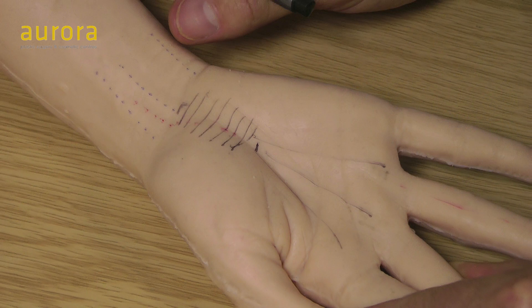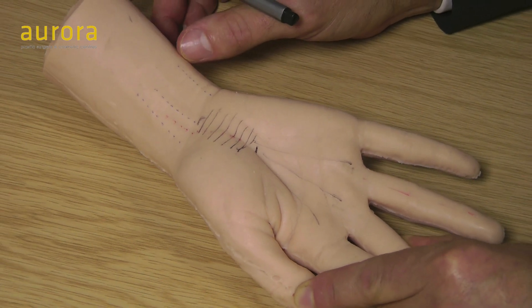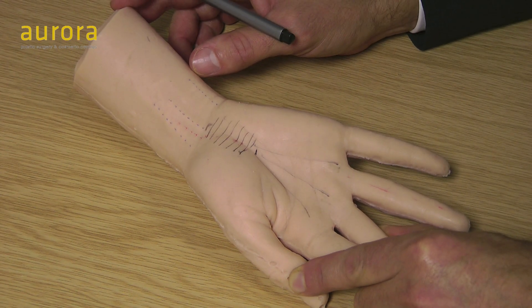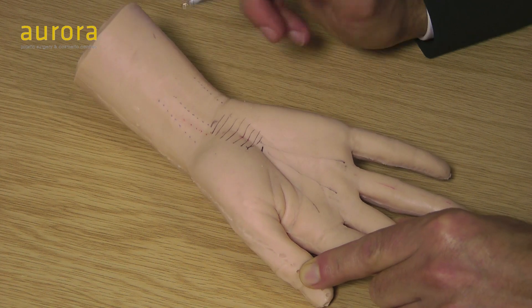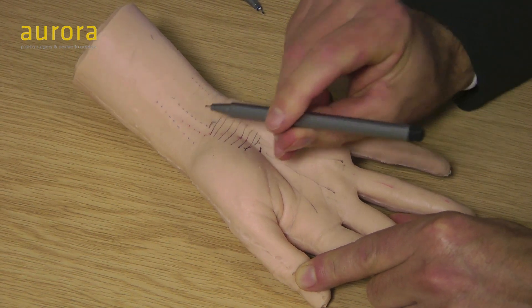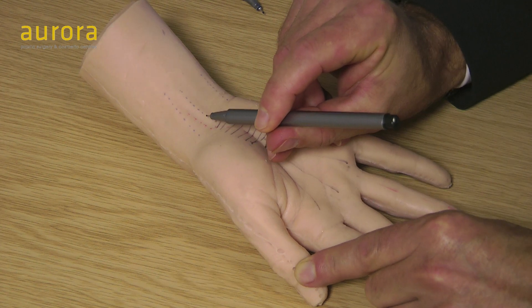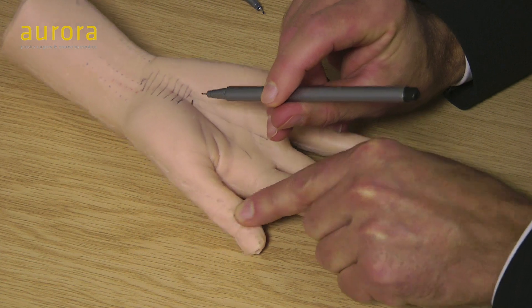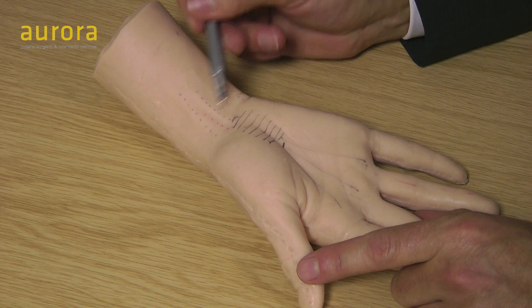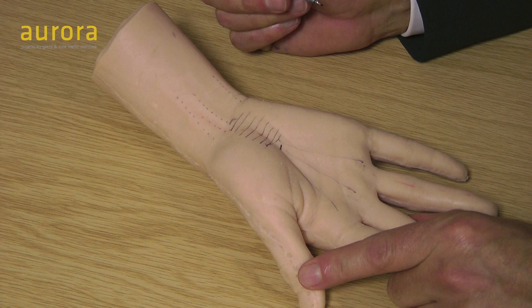Where are you going to inject to relieve carpal tunnel syndrome? I normally inject one mil of plain lignocaine and one mil of triamcinolone 10 milligrams per mil. You can inject either direction, but my preference is to inject proximally — because if the patient pulls their arm away suddenly, they'll pull it away from the needle rather than into it — and the steroid will spread down under the fascia into the carpal tunnel.